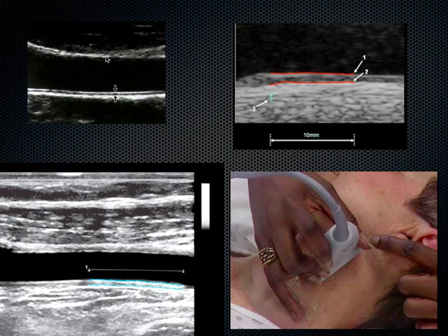So this is the anterior wall of the carotid, this is the posterior wall. As the sound goes through the neck muscles and then reaches the carotid, the blood in the carotid is low attenuating material, and so the posterior wall of the carotid is very easy to visualize, and we can see this little separation here, and that's the intimal medial thickness. So you just measure from this wall down to this wall, and you would drop a caliper right along here, and that distance hopefully is small, around 0.6 or even smaller for the young models that we'll be using this on this week.